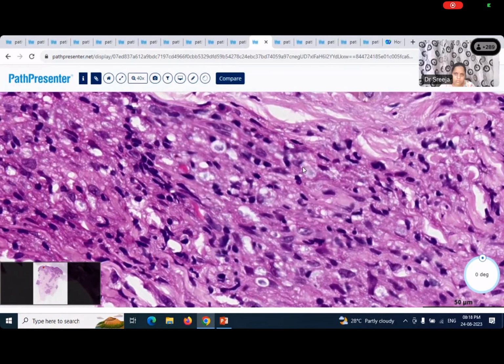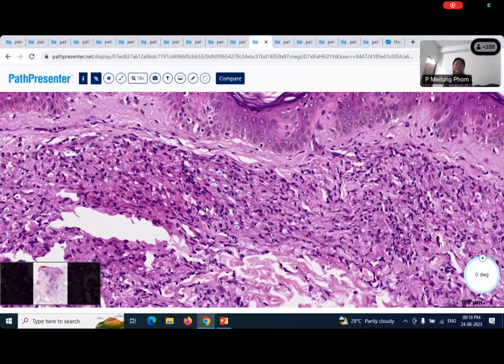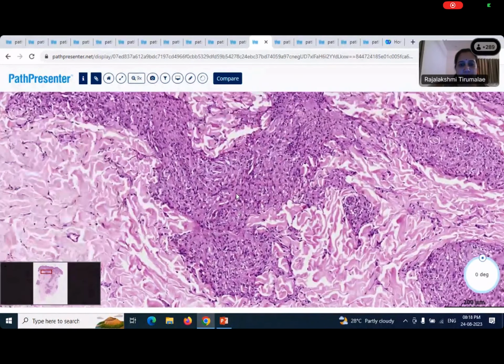So this is not really called the blue-gray cytoplasm. This is a typical word used to describe it. So you have foamy histiocytes with blue-gray cytoplasm, right? So what is the blue-gray? We'll come to it later. And I'd like to point out one more feature.